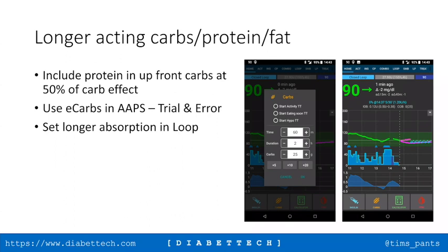Right. So that will be the reason for you not getting SMBs, because you've got very low numbers on your basal rates. The default setting for an SMB is a maximum of 30 minutes of basal. There are other constraints on SMBs as well. And what it will be doing is calculating that because of her low basal rates, probably quite a large number for carb ratio, she doesn't need that much insulin that can be given as an SMB. That's usually the reason in those circumstances why you're not getting SMBs.